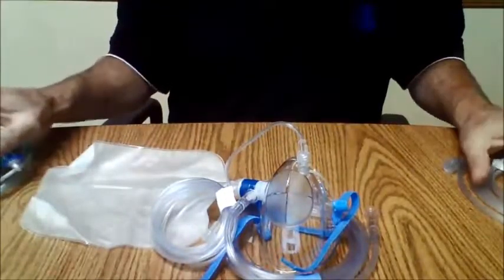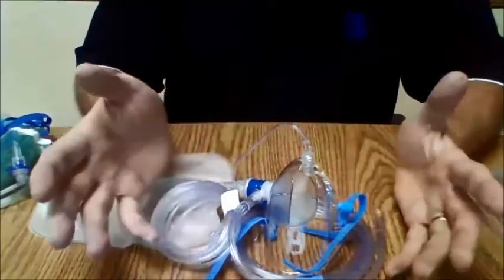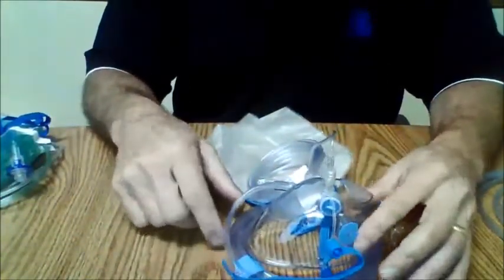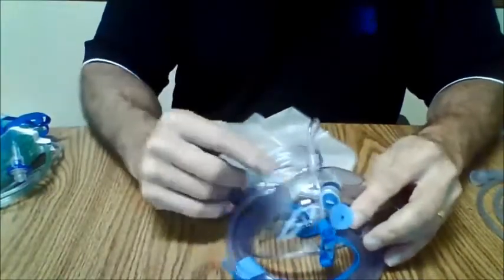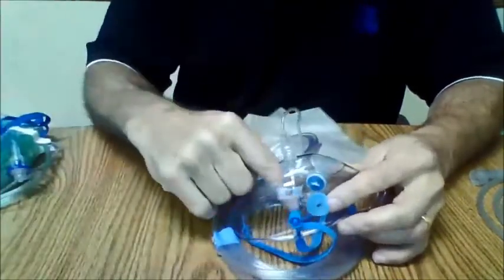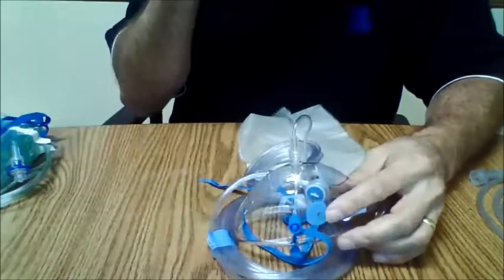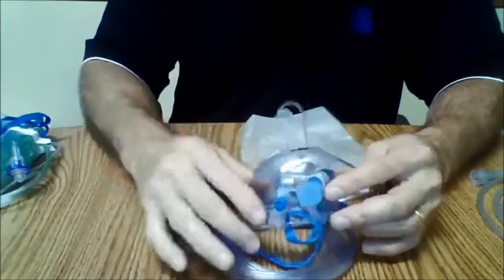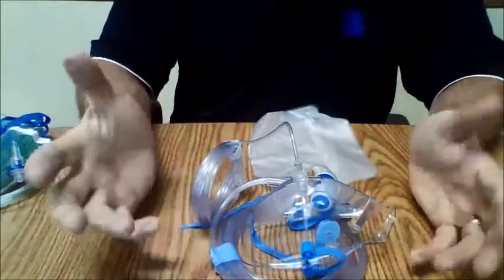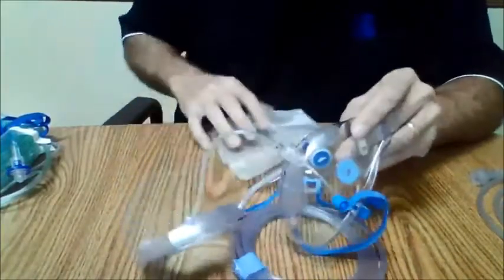The Capno mask and the Capnoxygen mask are generally masks that are in the $4 and under range. The POM mask is in the $8 range. So it's significantly more expensive, but it's for procedural sedation for upper GI procedures. What they will do is break through this initially, and then they might put a little lube here, and then they'll use a bite block, and they would send the GI scope through the opening here and through the mouth and into the esophagus or the trachea, depending on what they're analyzing. This mask with this oxygen reservoir has been known to deliver up to 90+% inspired oxygen. So what happens is I give oxygen here, it inflates this bag.